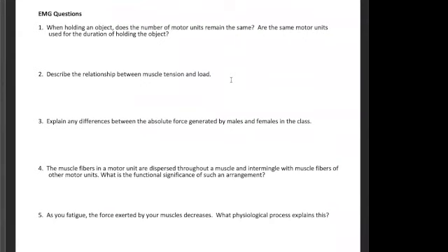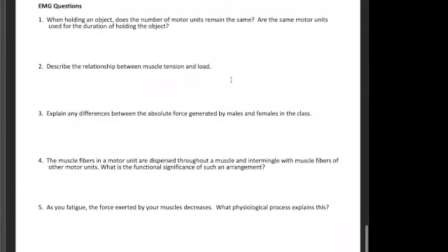I'm going to try to keep this as short as possible so that you can get through this fairly quickly. But I'll go through a few of these more difficult questions, so that for those of you who weren't in class, you get the same experience as everybody who was there. I went through numbers 1 through 4 for the people who were in class, because those are the more difficult questions in this lab. So let's take a look at the BIOPAC exercise and how that works.